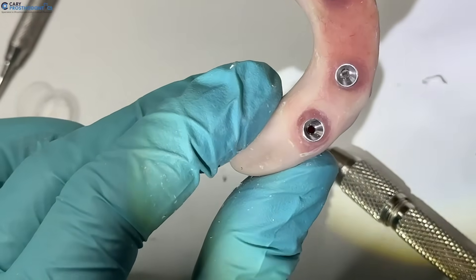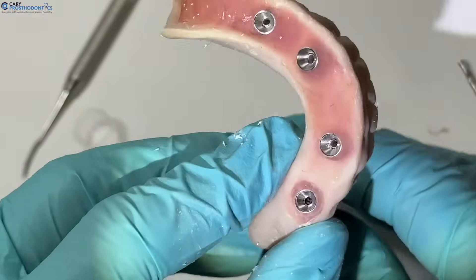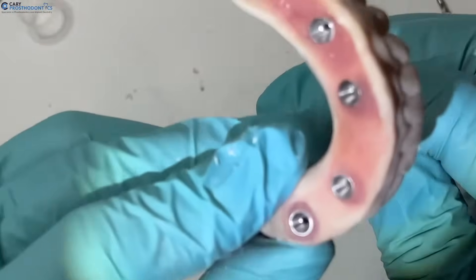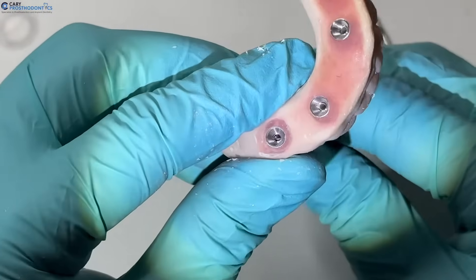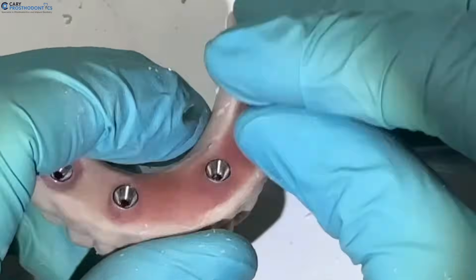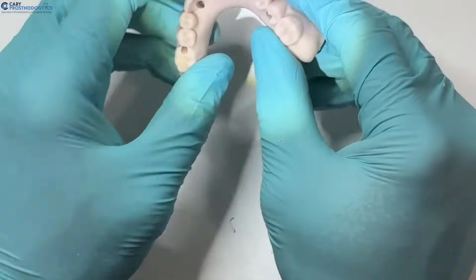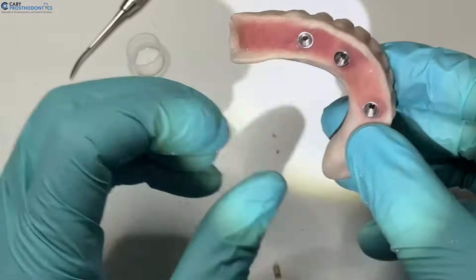There's the separable fastener removed. When you look at the inside of that tie base, there's no separable fastener present. If you take that last reamer drill and stick it through, you'll see the tip engages all the way to the end. Now that screw access is completed, let's get ready to contour.